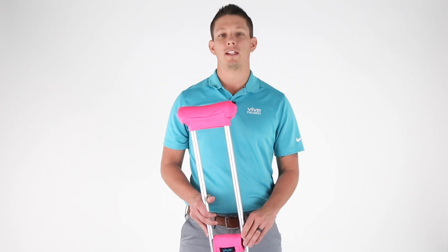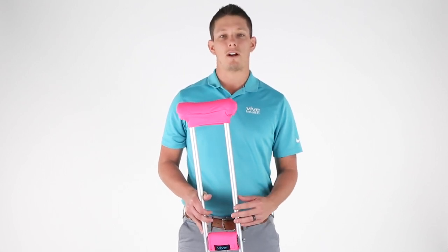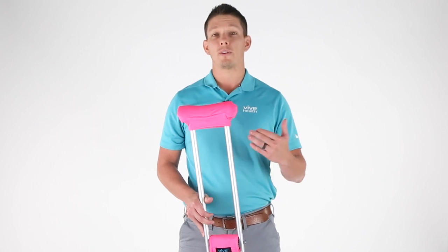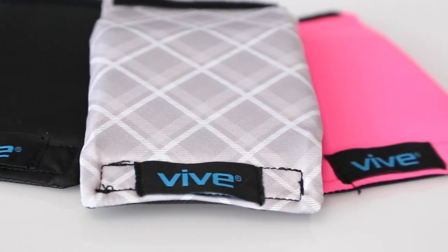Our pad is moisture wicking and helps quickly dissipate heat and can stay cool and dry. Our foam padding both under the arm and hands reduce pain points and fatigue. Also comes in various colors.